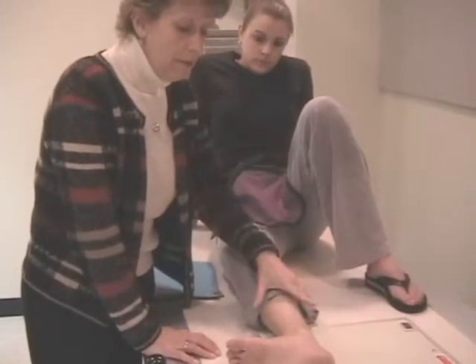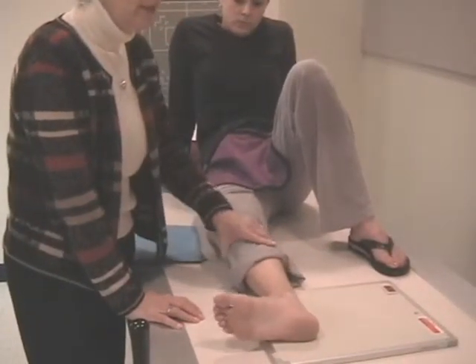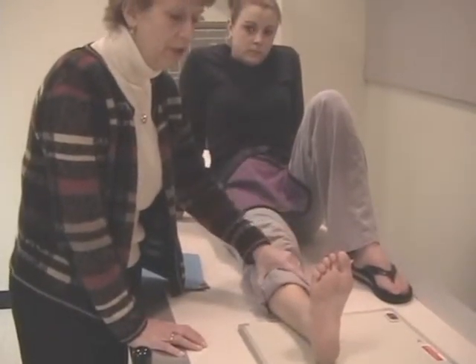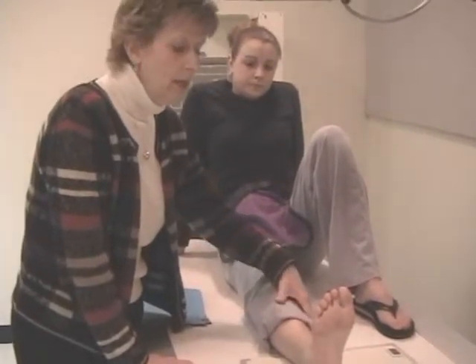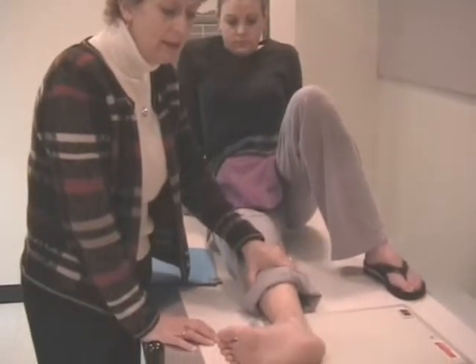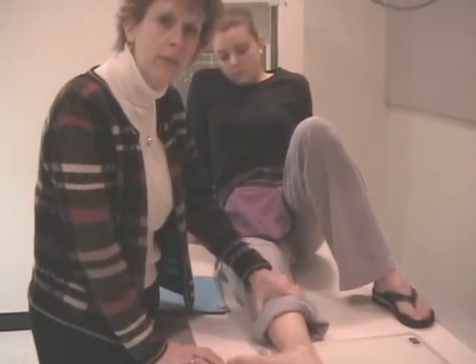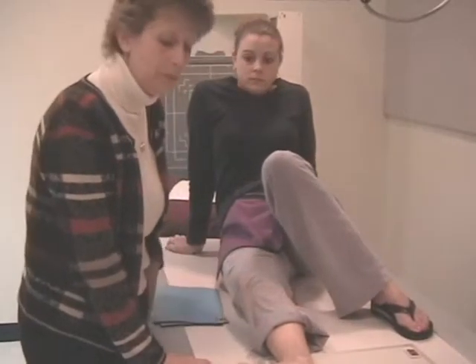Okay? Now, the foot is flat. What's 90 degrees from a flat foot? It's foot straight up in the air. Okay? So nationally, the foot is straight up in the air for an AP, and that's how we do our AP. 90 degrees opposite of that is with that foot flat. But with the foot flat, the fibula will lie posterior on the tibia. That is acceptable according to that protocol.